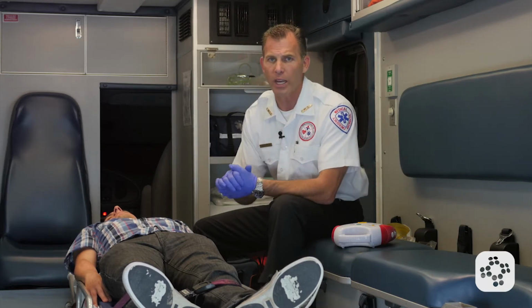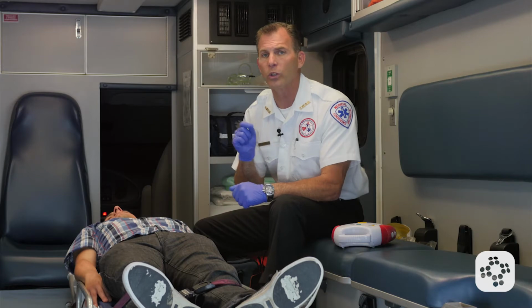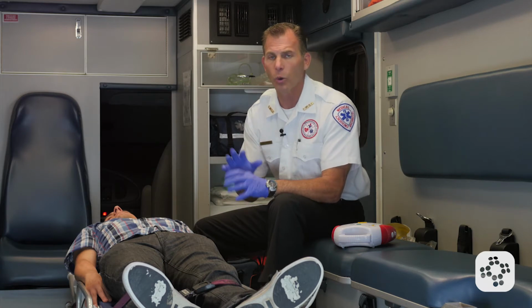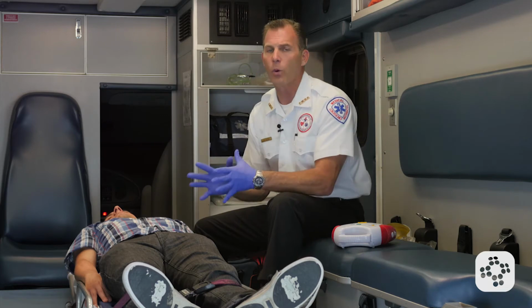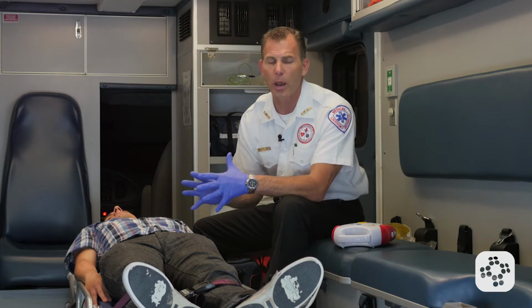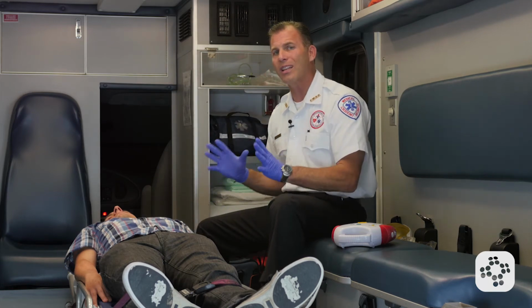We should be okay. If it's a pregnant female, there should be no complication other than understanding that when you're saving your primary patient, the mother, we're also saving the baby in most cases. So we do have 2 patients here, but we have to take care of mom if we want to take care of baby. So we're going to be just as aggressive, and we do not have to worry about hurting the baby and putting them in any more jeopardy than we already know them to be in with the fact that mom is in cardiac arrest. So keep those things in mind as we go through this step by step.